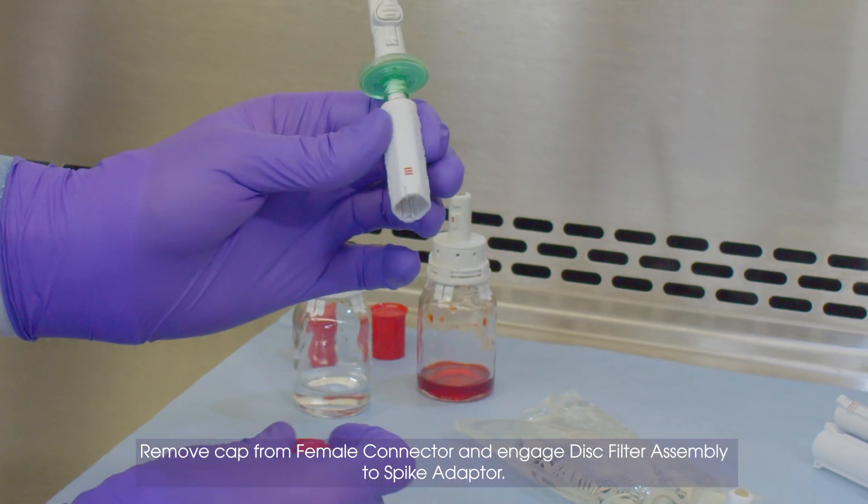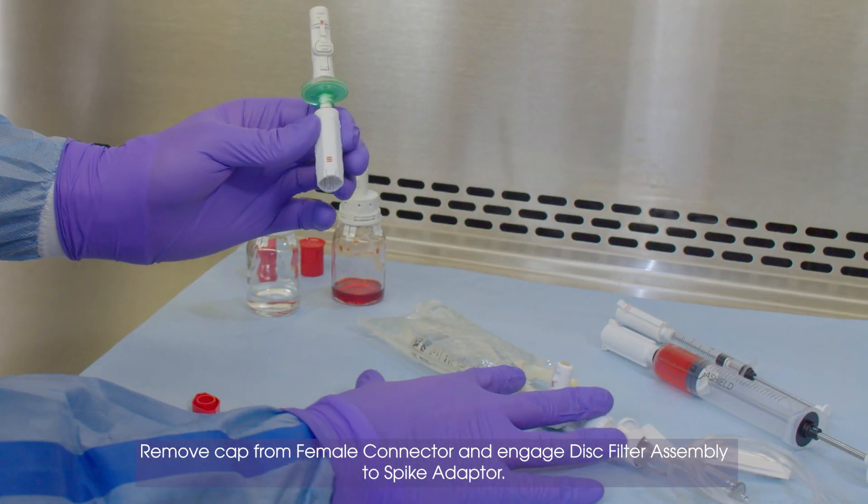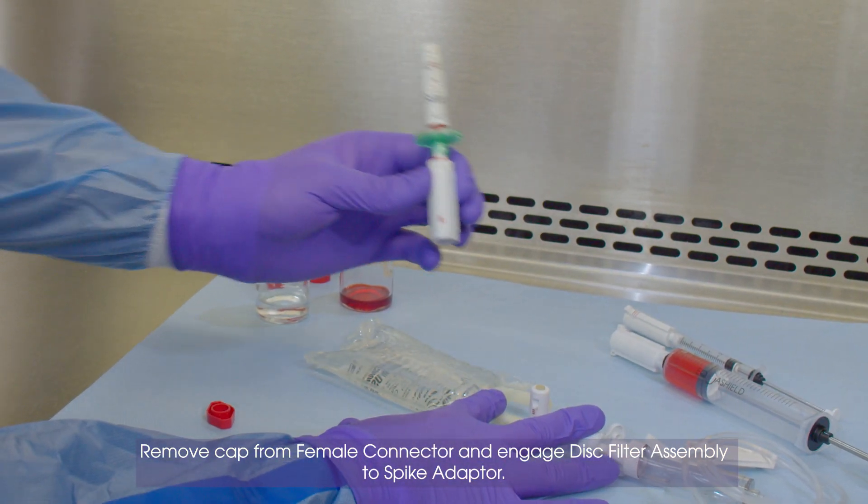Remove Cap from Female Connector and Engage Disk Filter Assembly to Spike Adapter.